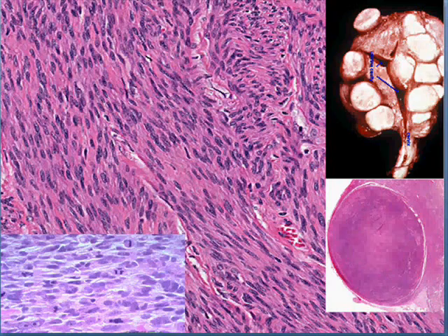Let's take a theoretical tumor. This is a uterus here in the northeast corner. These little white nodules are balls of smooth muscle tumor arising from the smooth muscle of the wall of the uterus, which is called myometrium. Generally speaking, if a tissue arises from an area, the cells may look similar to those from which it arose.